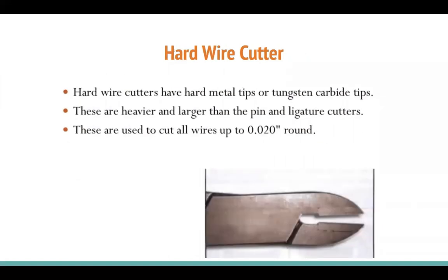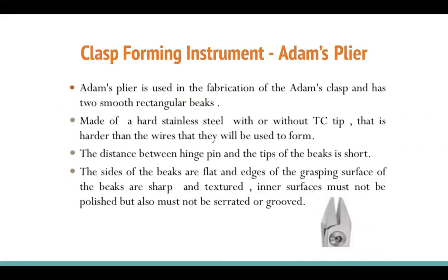Keep a hard wire cutter in the clinic for any situation requiring cutting hard wire or adjusting appliances, so you don't damage your expensive instruments. This hard wire cutter is inexpensive and can have a metal or tungsten carbide tip — I recommend just a metal tip since it's not used often. These are heavier and larger than pin and ligature cutters and are used to cut all wires up to 0.02 inches.